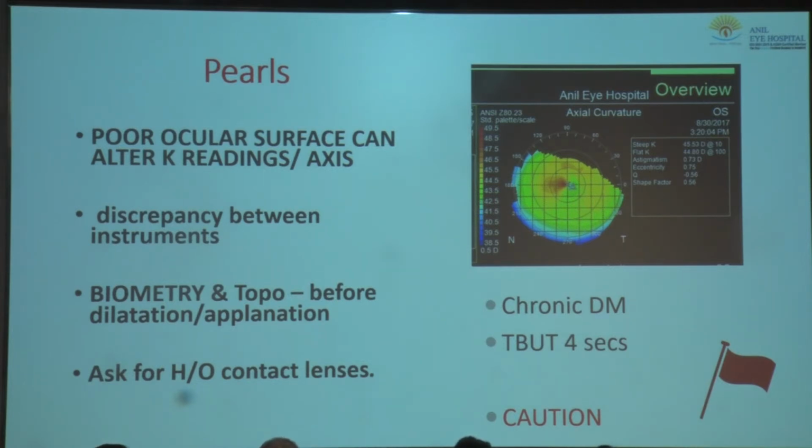While doing biometry, be very careful: no dilatation, no applanation to be done before biometry, and also ask for history of contact lenses.